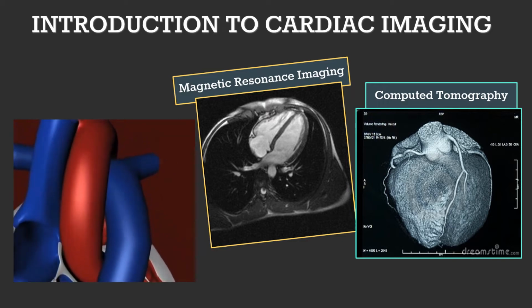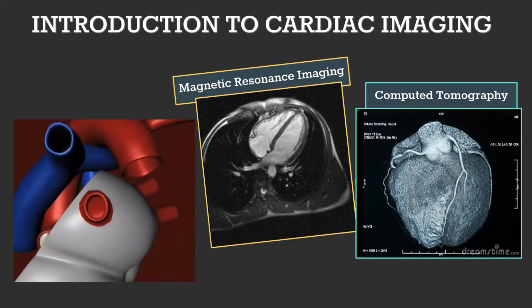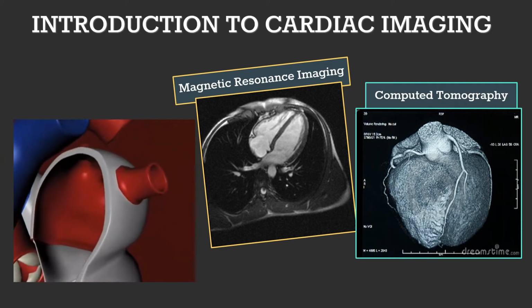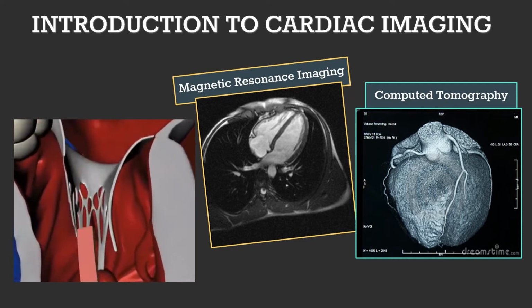In recent years, due to technical advances and improvements, cardiac CT and cardiac MRI have provoked increasing interest in the potential clinical role in the non-invasive workup of patients with suspected heart diseases and also in correct patient selection for these emerging imaging techniques.